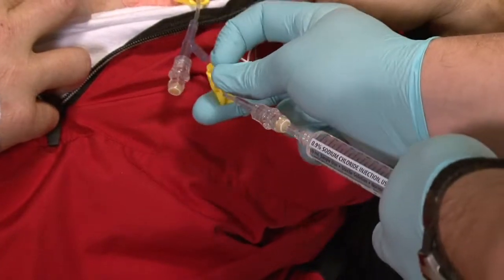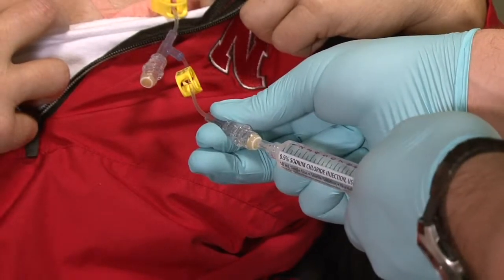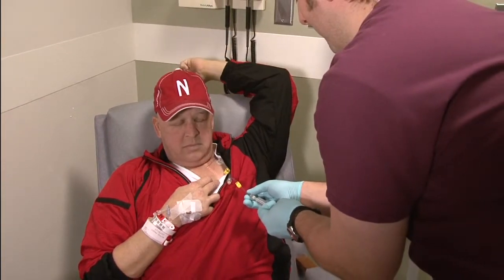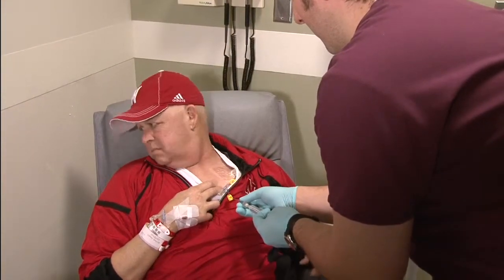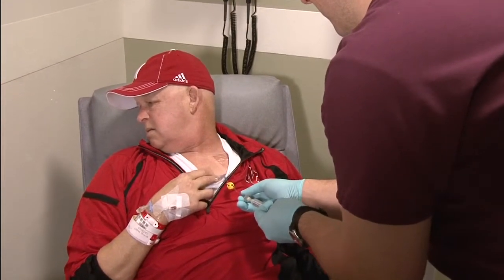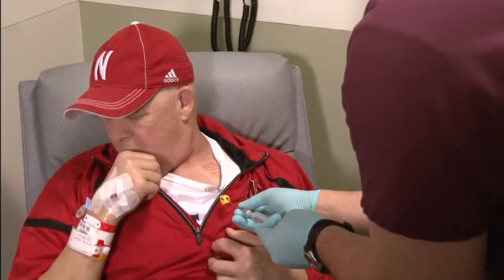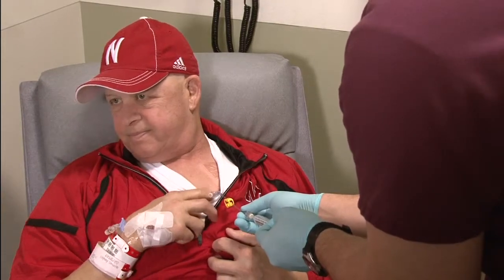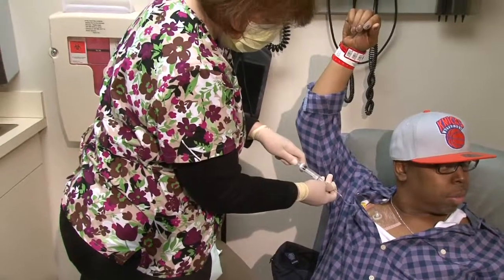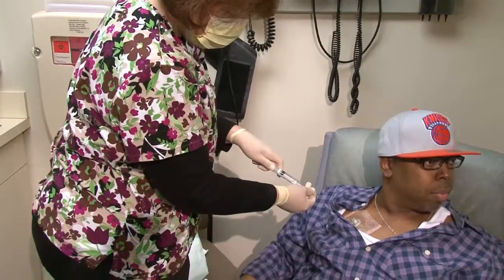The care provider will first look to see if a lumen is bent or if a clamp on the catheter was not open before they attempted to flush or use the line. If this isn't the problem, then the care provider may ask you to change the position of your body by lifting your arm above your head or turning your body from side to side. The care provider may also ask you to cough forcibly. Movements like these can change the position of the catheter enough to allow the line to open completely. If these position changes do not resolve the problem, the next step is to remove the access cap and flush each lumen or draw blood by attaching the syringe directly to the end of the catheter lumen.